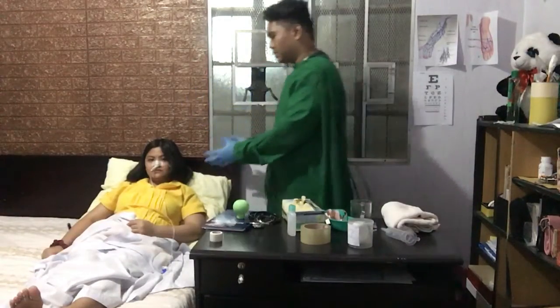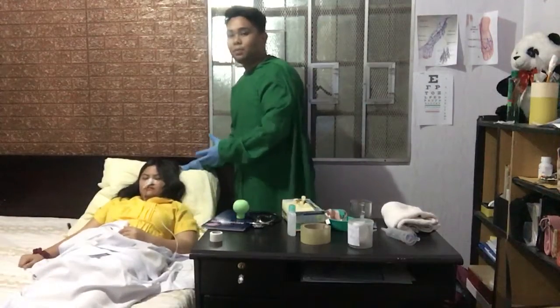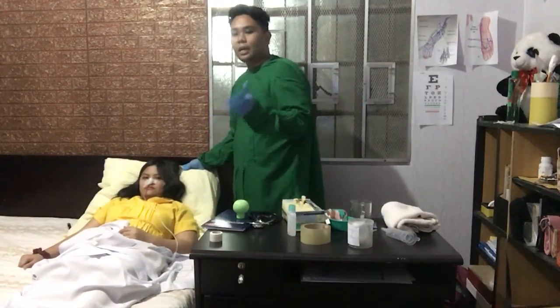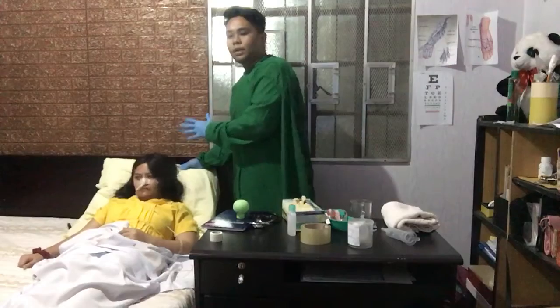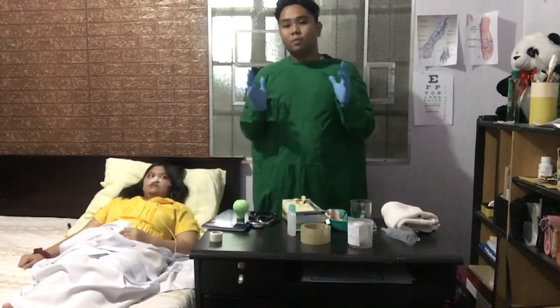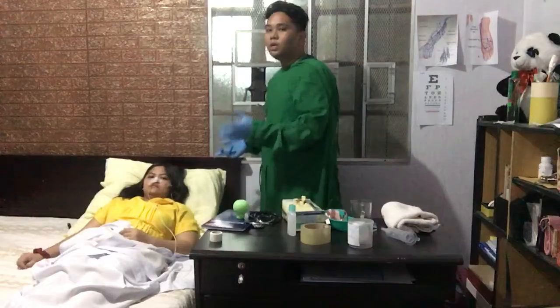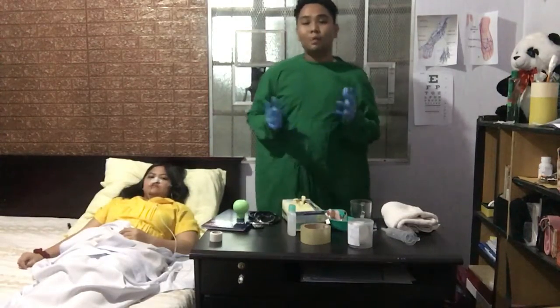Then, we remove the equipment that we used and return the patient to a position of comfort. So, for example, our patient is now comfortable, but still in an upright position, because as we said earlier, the patient needs to remain that way for 1 hour. Then, we remove our gloves. Assuming we have removed the gloves, we raise the side rail to provide safety for the patient. Then, we put on gloves again.